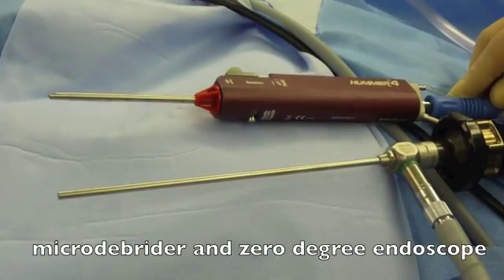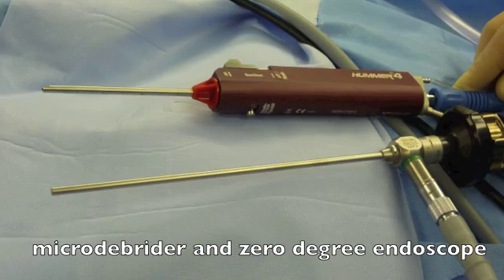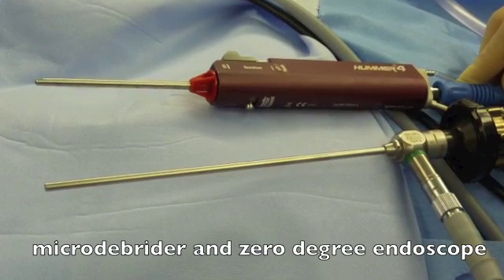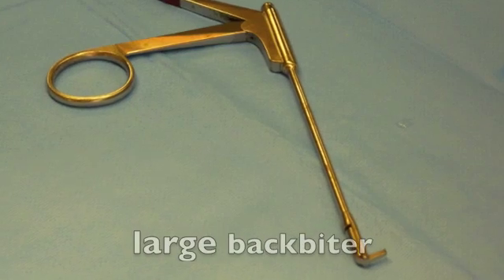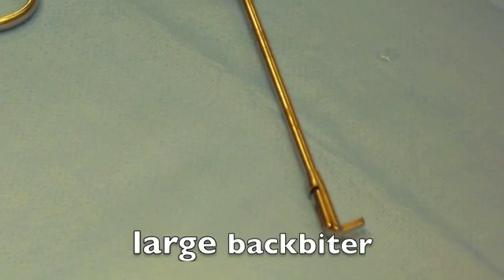Some of the items you will see used in the surgery include a microdebrider, an endoscope attached to a camera, and a large backbiter.